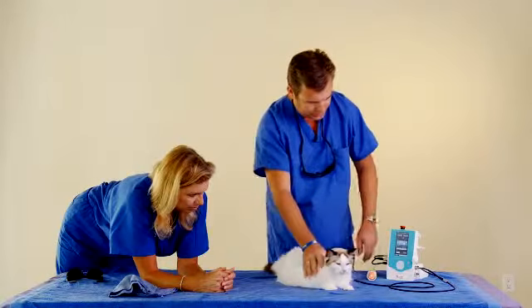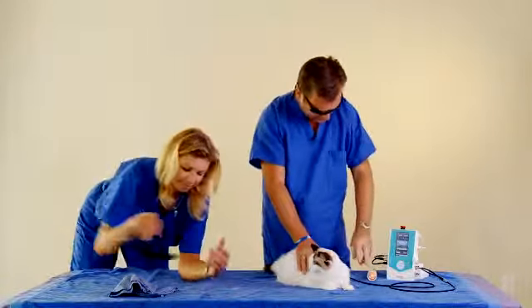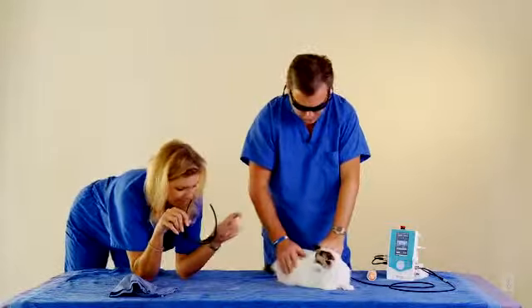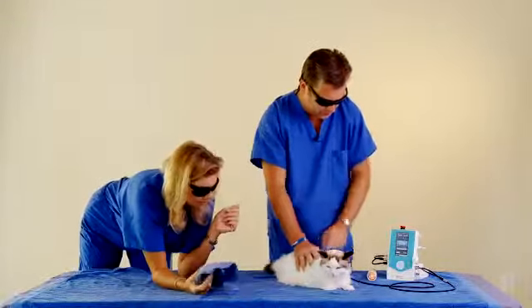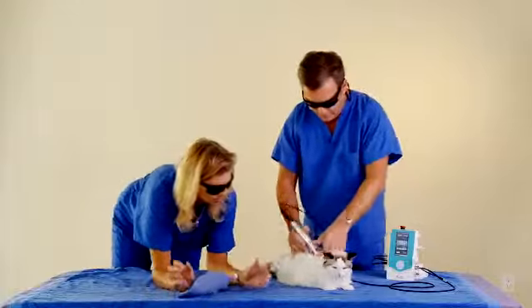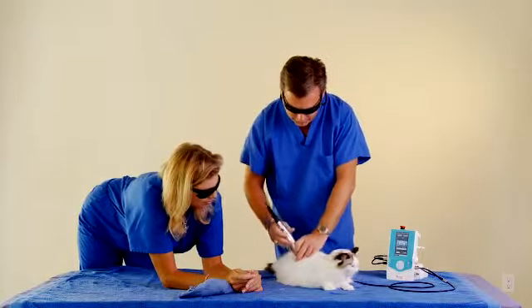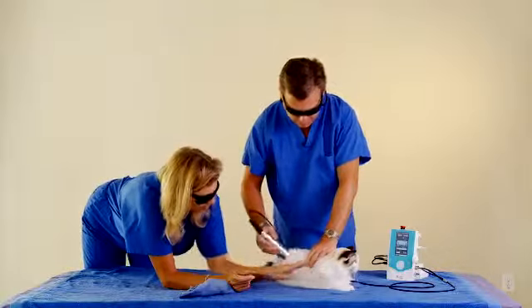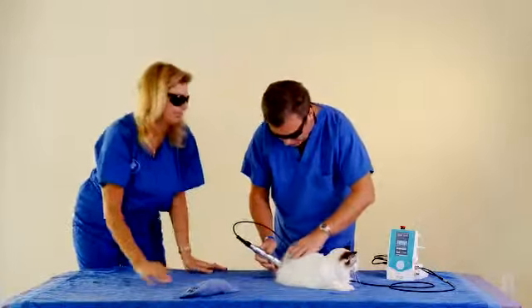So once you get it kind of comfortable with everything, go ahead, put your safety glasses on. If you do have a little bit of a nervous cat, which she isn't, but we have an assistant here to help hold her if she does get a little antsy, and just go to it. At this point, you depress your button. I do have the wattage turned down a little bit because she's a smaller cat.